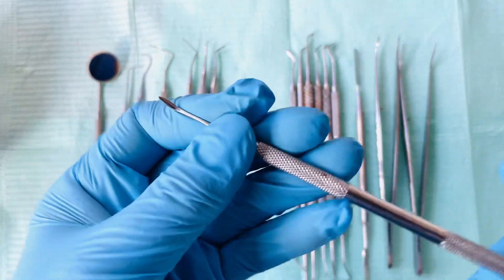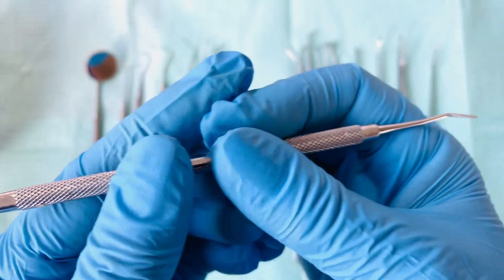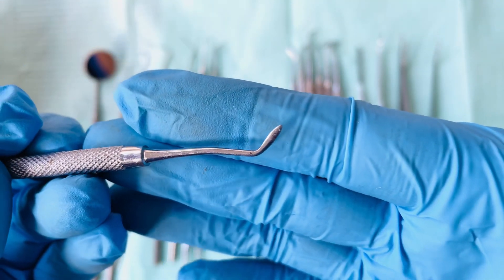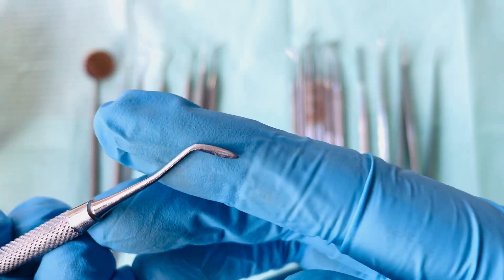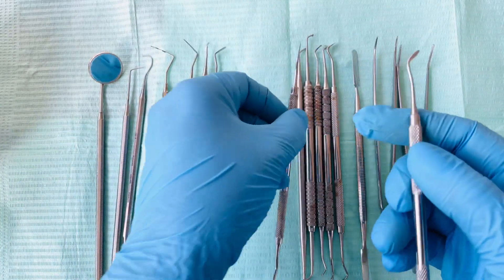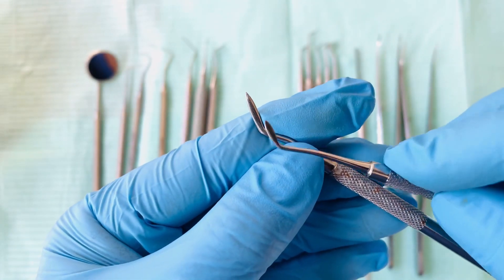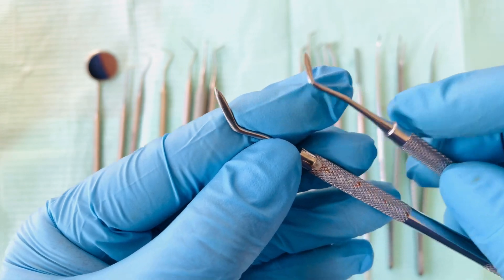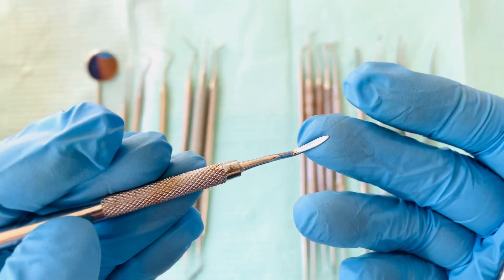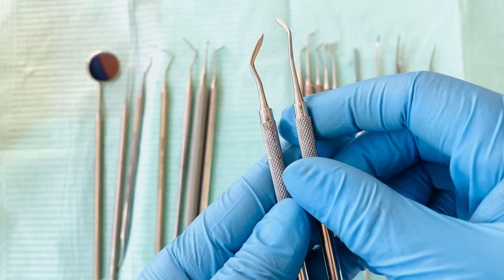Next we have the amalgam carver. This is used to carve the amalgam filling. The amalgam carver comes in different shapes and sizes — this is a shorter one, and this is also an amalgam carver but with a longer end. They are the same use: to carve your amalgam fillings.